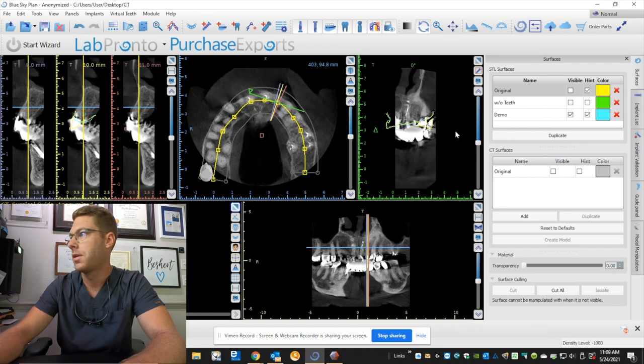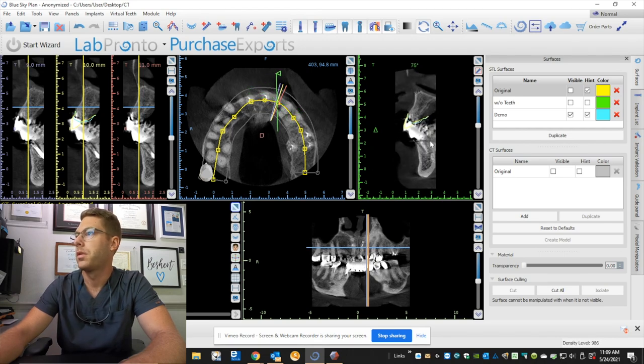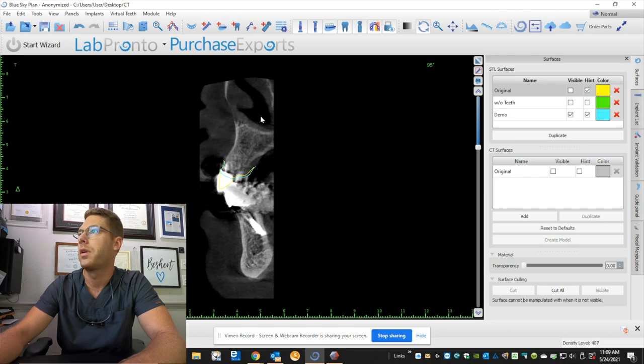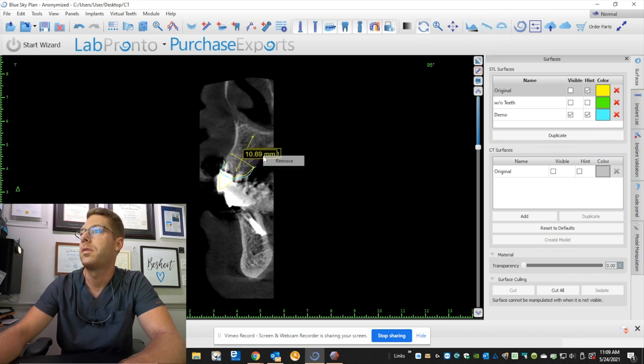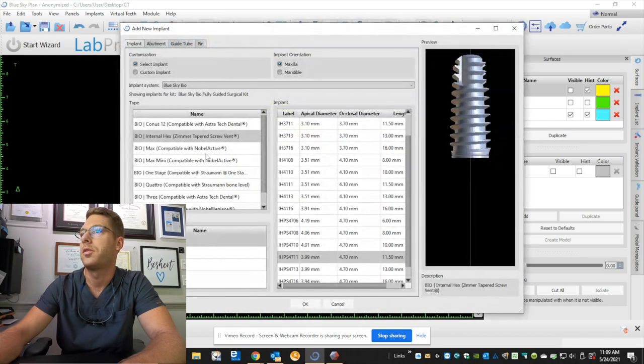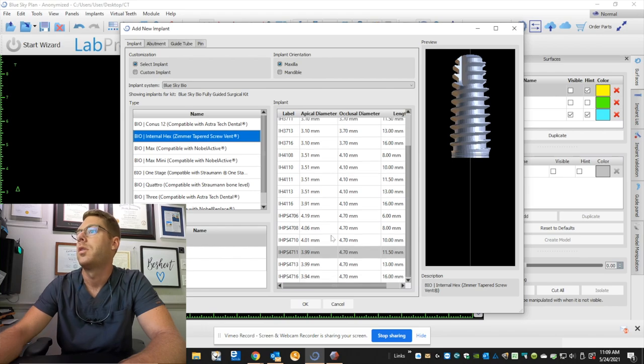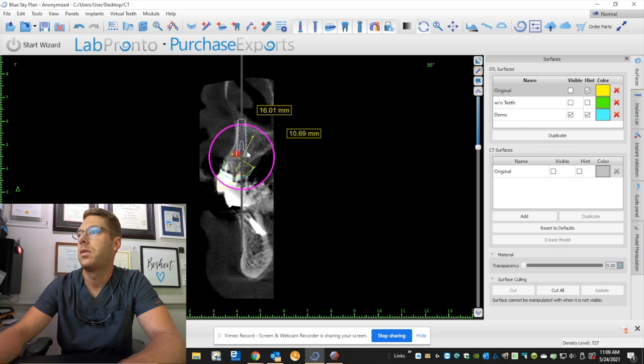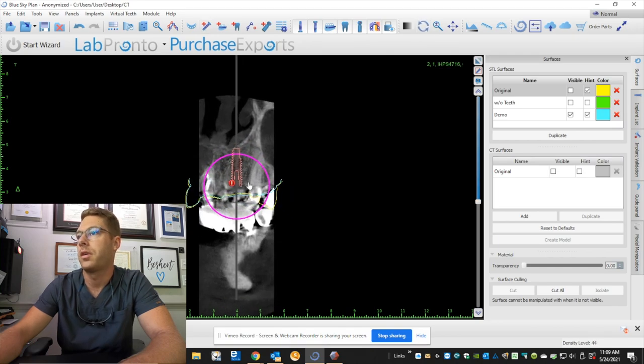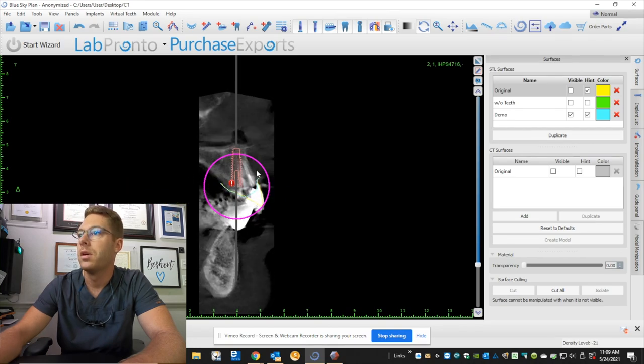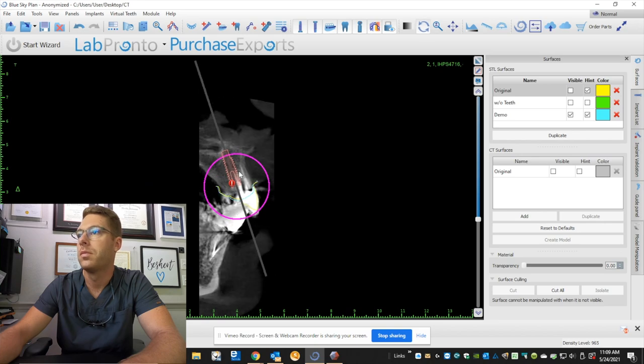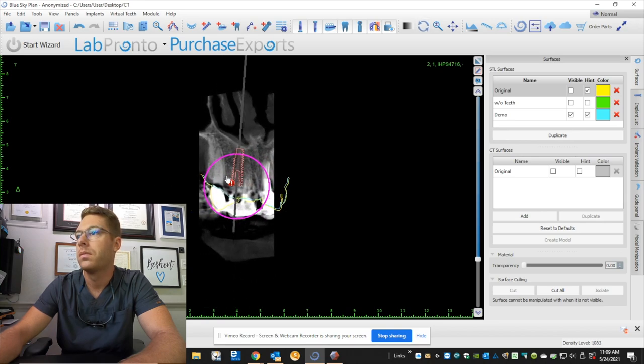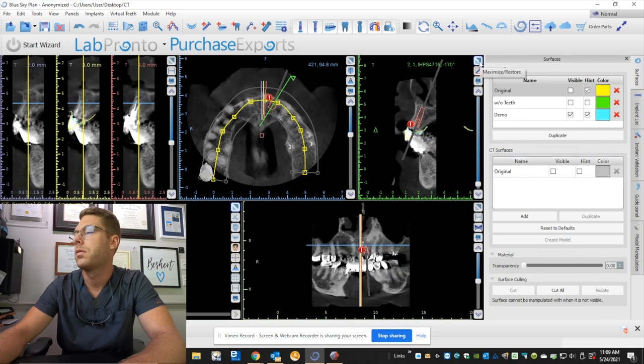First, I go up here, and I measure what my working length is going to be. So it looks like we have a distance of about 16 millimeters by 11, which is plenty of room to place an implant. I place zimmer tapered screw vents. Let's do a 4.7 by 16. That's gonna be plenty enough implant for this area. It's gonna be a lot of weight on this guy, but this implant size for an anterior tooth is just awesome.